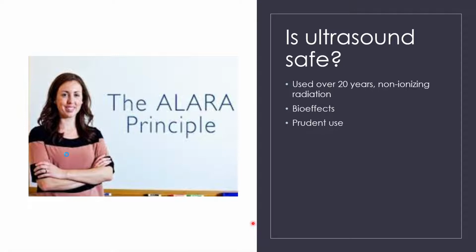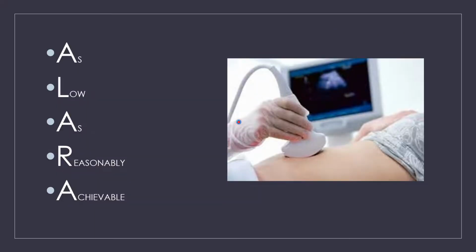Okay, and the reason we've got the ALARA principle up here, we'll see that in just a second on the next slide, what that actually means, okay? So ALARA stands for as low as reasonably achievable. This is an acronym, or a phrase that's used in x-ray a lot of times because they want to reduce the amount of radiation that goes into the body, or just reduce the amount of patient exposure.